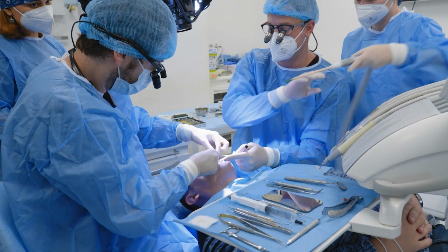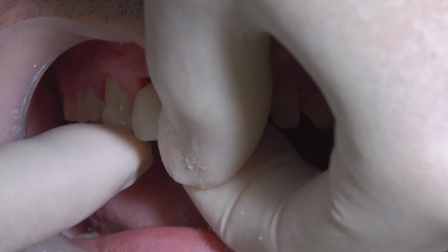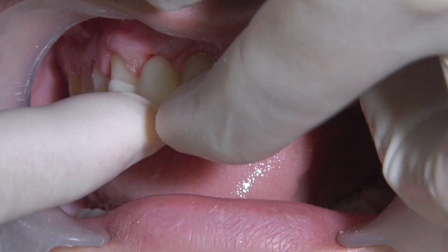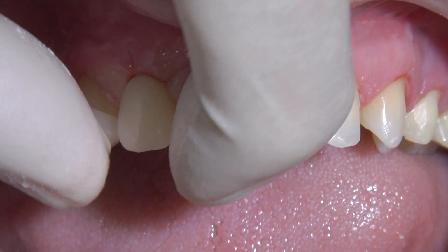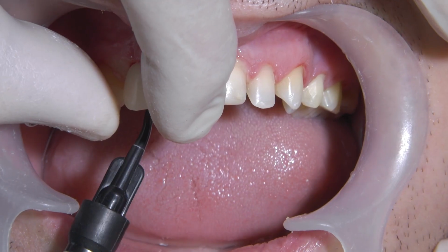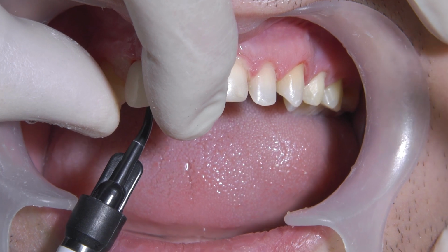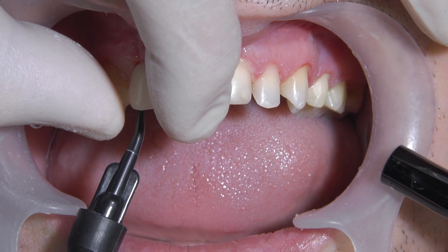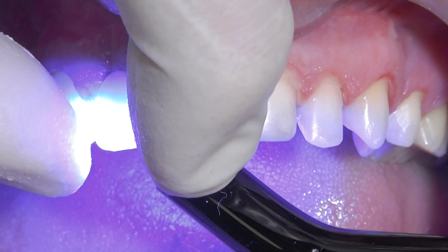Super. I put the provisional in position. Just need to feel that we are perfectly in position. Let's check the buccal view here. Okay, we are. I hold the two wings. I take my flowable composite. There. Light cure.